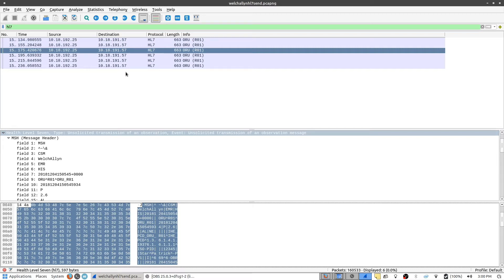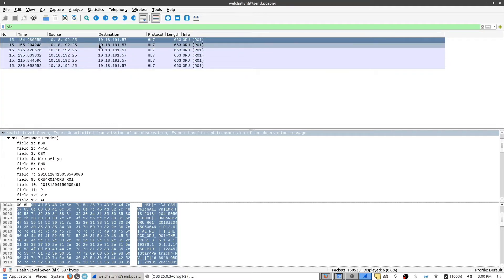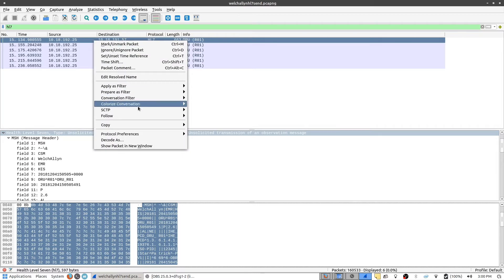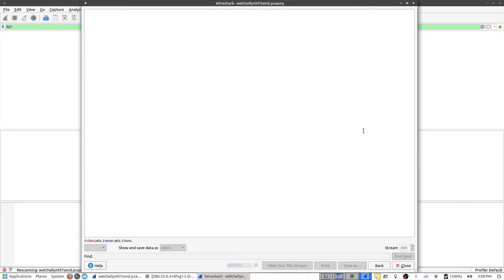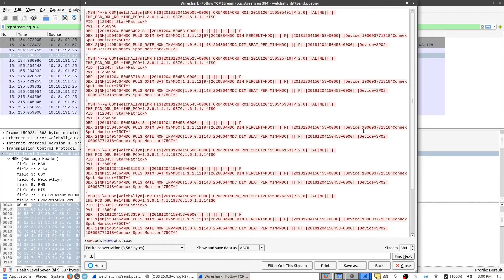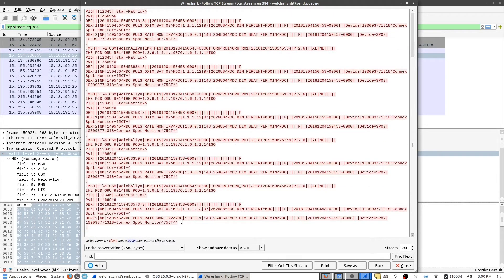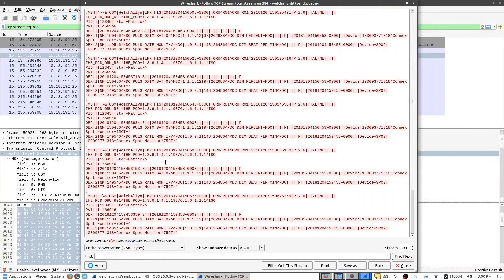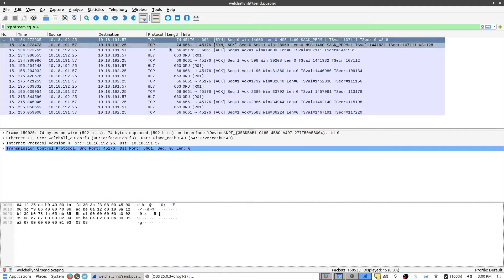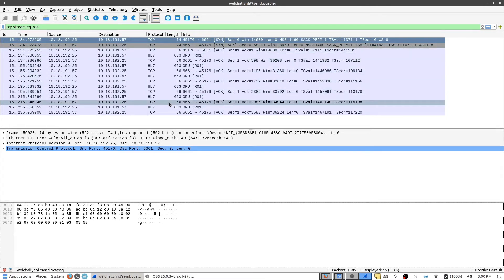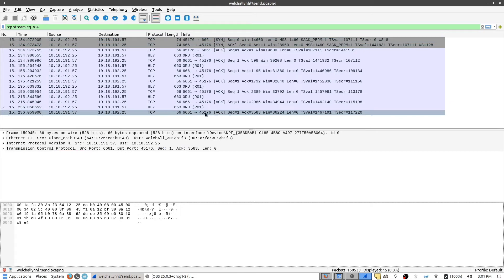In and of itself, it's not enough to get the full context of what's going on. So what we can do is take any one of these packets at the top, right-click on it, go to follow, and then follow TCP stream. What that will do is take the entire conversation from beginning to end between the two machines. We can see that it's sent the HL7 data multiple times. If we close this, you can see this is the entire conversation — it starts with the TCP handshake, sends all of the information from the Welch Allyn to the server, and then finally closes the connection.